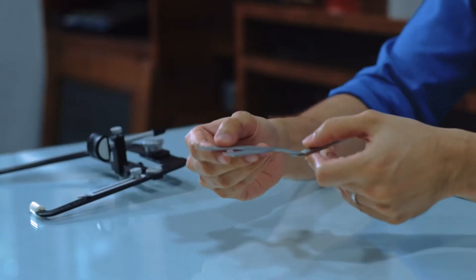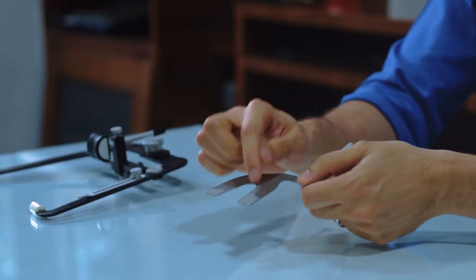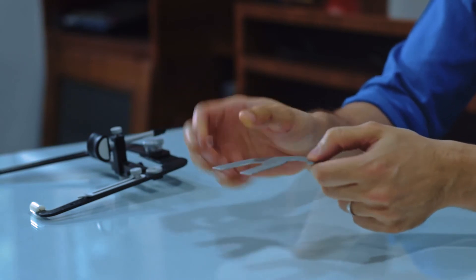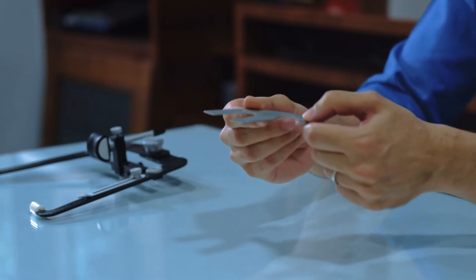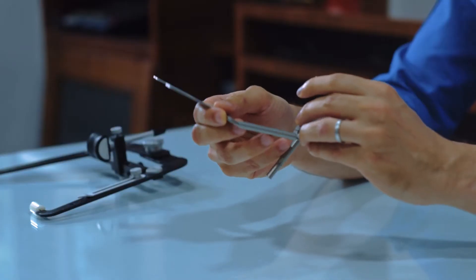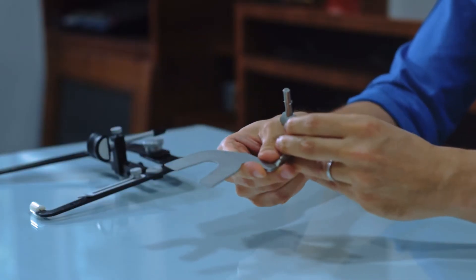Now, coming to what actually goes into the patient's mouth — this is the bite fork. You can either use compound here, some impression material, or a bite registration material, and seat this into the patient's mouth. Once it's seated, you have the transfer assembly here — I'm not sure exactly what Panadent calls it, but I just call it the transfer assembly.